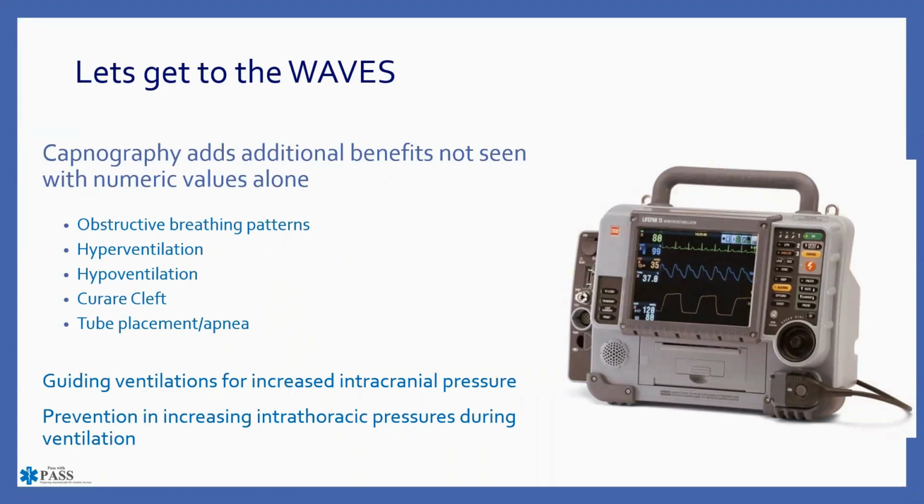But as that mental status continues to decrease, and we're now worried about them blowing a pupil or having unequal pupillary function, that is when we know that we're now dealing with a patient with increased intracranial pressure, and we need to make sure that patient is ventilated to an end-tidal CO2 of the low end of normal, somewhere around 35, maybe 30, maybe a call to medical control. Hey, this is what I've got. I'm ventilating at 35. Do you want me to drop their CO2 a little bit lower? If you're calling a trauma center and it is presented like that, I can almost assure you they're going to tell you to drop their end-tidal CO2 a little bit lower than 35, probably around 30 or so.